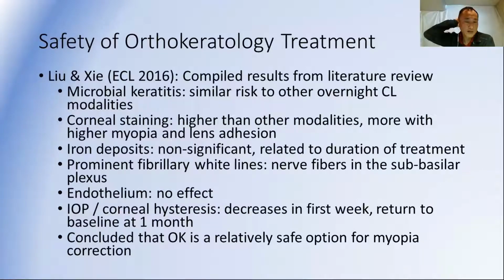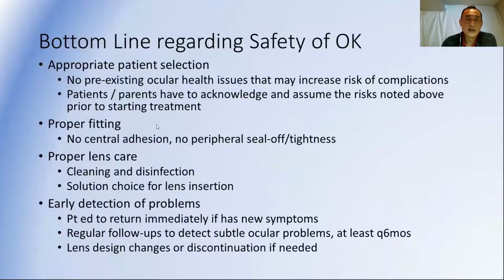Okay, so bottom line in terms of safety, compared to other contact lens modalities, you may see certain changes, but overall it's relatively safe. And as long as the patients and parents understand the increased risk of microbial keratitis compared to non-lens wear and daily lens wear, most parents are fine to go ahead with it. What I do is I educate the patients and the parents extensively before we start to make sure that they understand that cleaning, disinfection, hygiene, and lens replacement and follow-up are essential for successful Ortho-K wear.